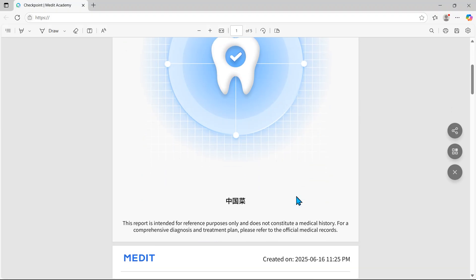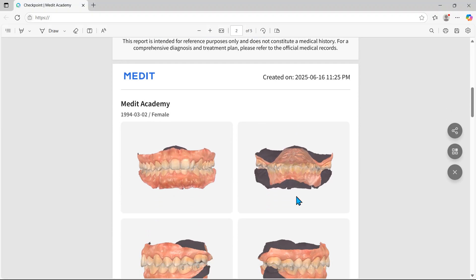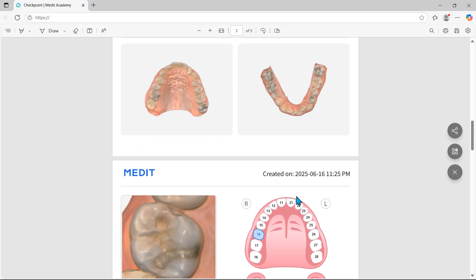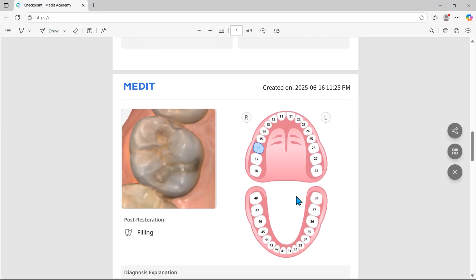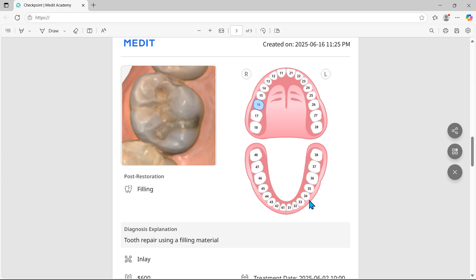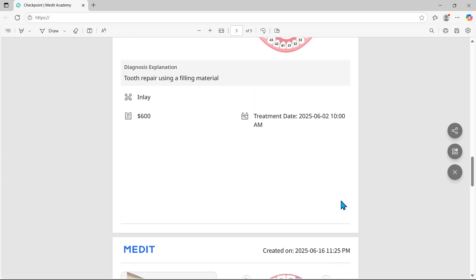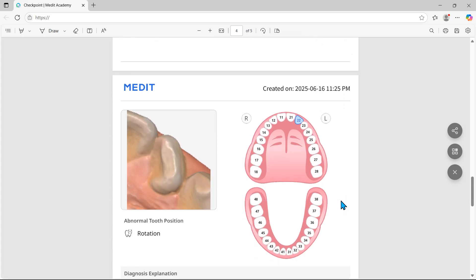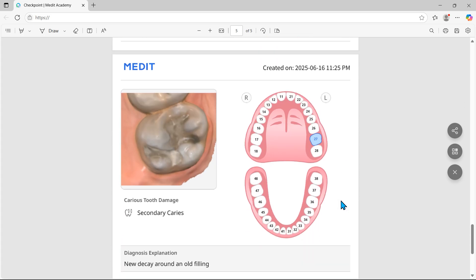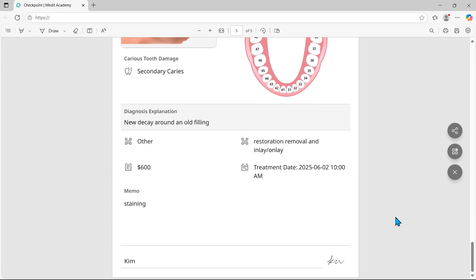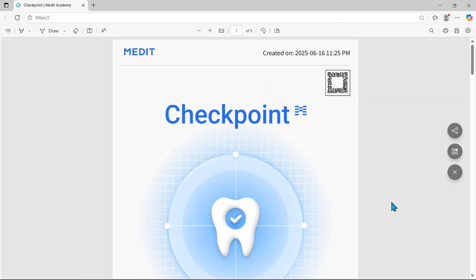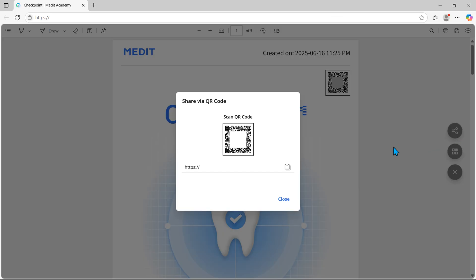With Medit Checkpoint, creating customized patient reports is quick and simple. It also facilitates transparent communication of treatment plans and costs to patients. You can also easily share the report via QR code.